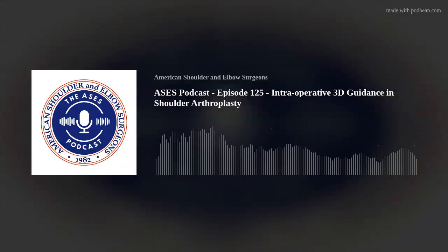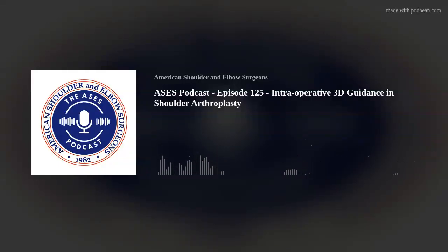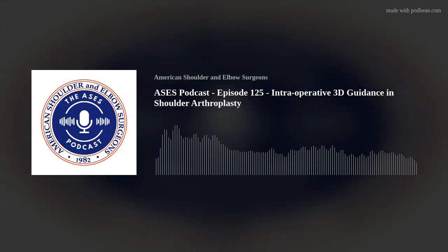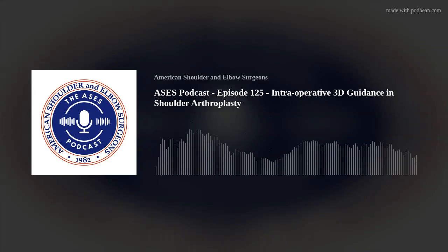Over time, as I've practiced longer, you learn tricks too on how to work the system, making sure that you document that there's bone loss. I think if there's bone loss, it's hard to let an MRI alone constitute your plan. You can do it certainly, but it's just a little less forgiving, more likely to have errors. So I think CT is better for that.